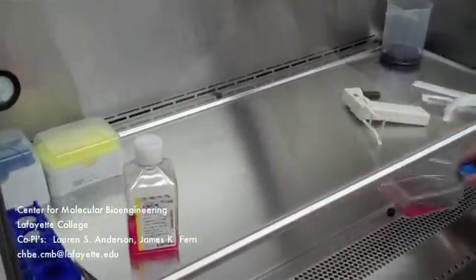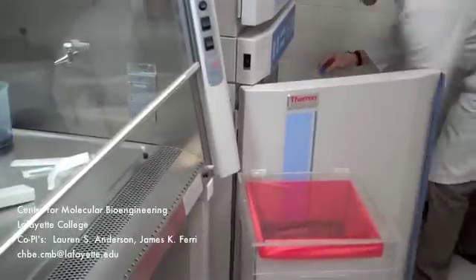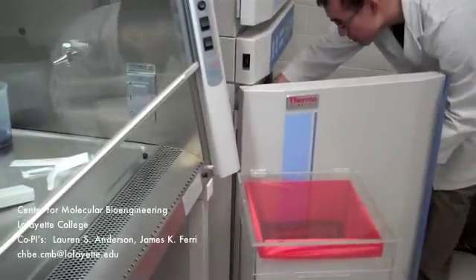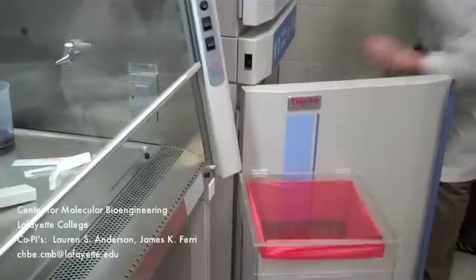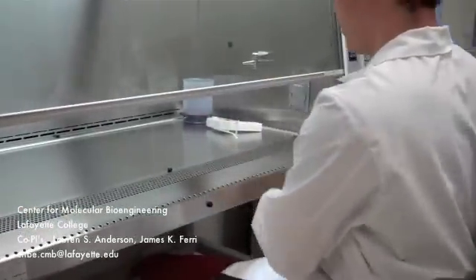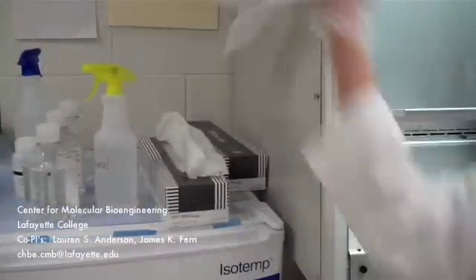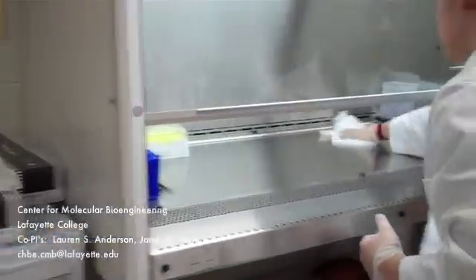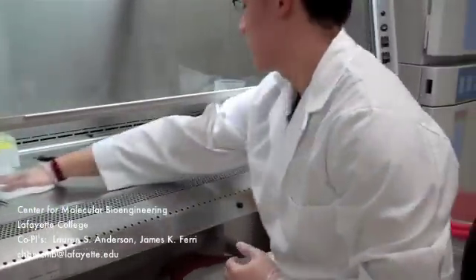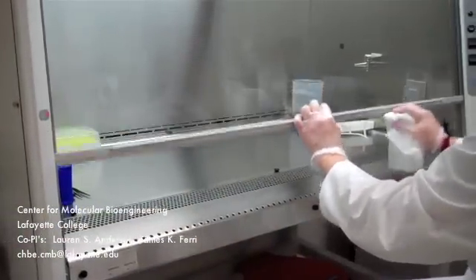Place the flask back in the incubator. Clean up the biosafety cabinet and spray the work area using isopropyl alcohol and wipe it down with a kim wipe. Close the sash of the hood.